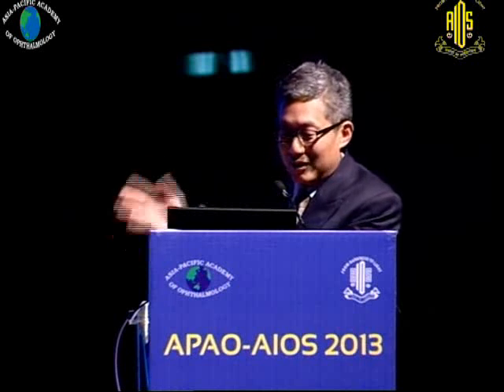Okay? But nonetheless, we'll go through this routine of staining with triamcinolone. Lo and behold, we pick up, now look over the fovea, we're picking up 1 layer of cortical vitreous. Well, I assume it's cortical vitreous. So 1 layer is off. Lo and behold, something else that looks like vitreous comes off too. Is it ERM or is it vitreous? Don't really know, but the second layer does come off.